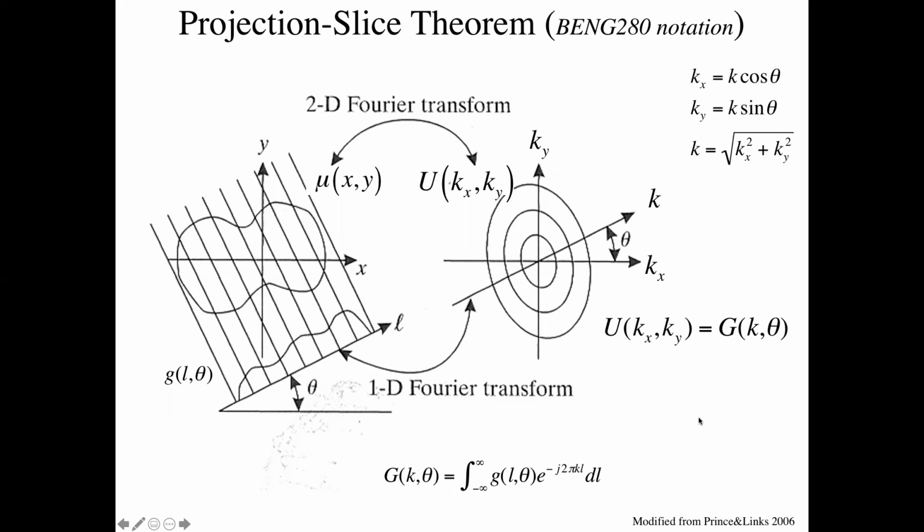All right. So we're going to understand the projection slice theorem, which is a really useful piece of information, a useful theorem. And the first thing we're going to do is look at, in the coordinates that we're used to, the two-dimensional Fourier transform of our image.